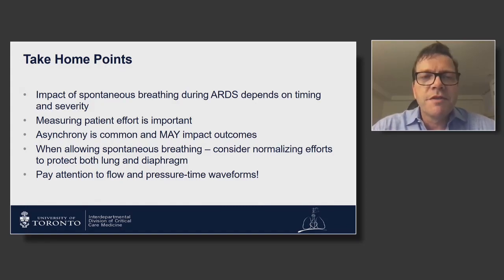I've tried to show you that measuring patient effort is potentially pretty easy and maybe important. Asynchrony is common, and that may have an impact on clinical outcomes. And when you're allowing spontaneous breathing, consider normalizing efforts to protect both the lung and the diaphragm at the same time. And overall, as you're getting more and more comfortable with ventilators, I'd encourage you to pay attention to the graphics that are on the ventilators and available. Watch those pressure and flow time waveforms that Tom was drawing for us a little earlier tonight. Next slide, please.